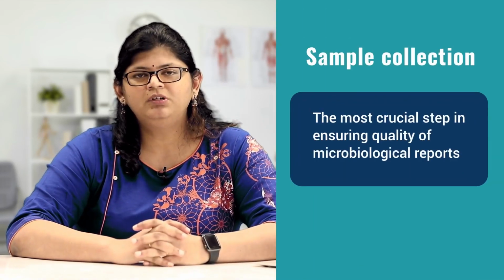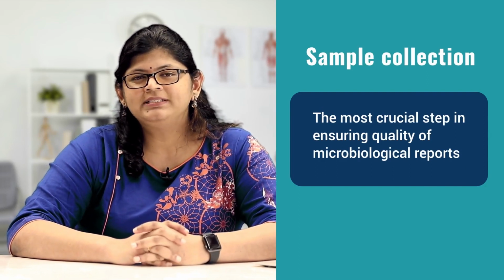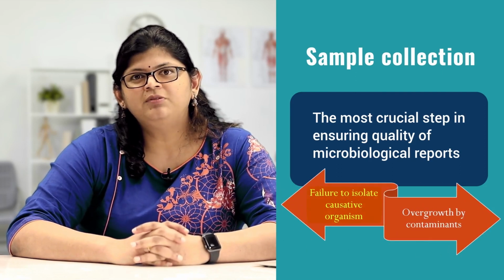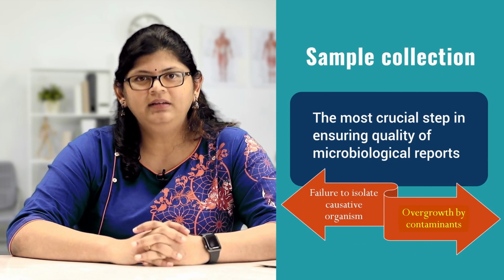Specimen collection is the most crucial step for determining good quality microbiology reports. So when adequate samples are not collected, two things can happen. One is the organism of interest can die off during transport delays, or there can be an overgrowth by contaminants.